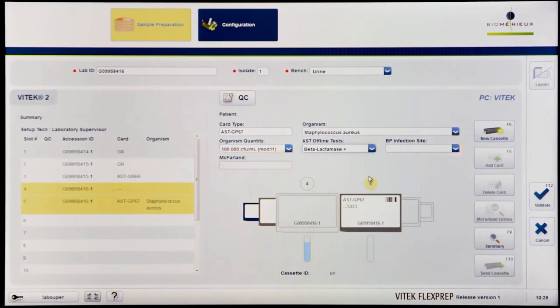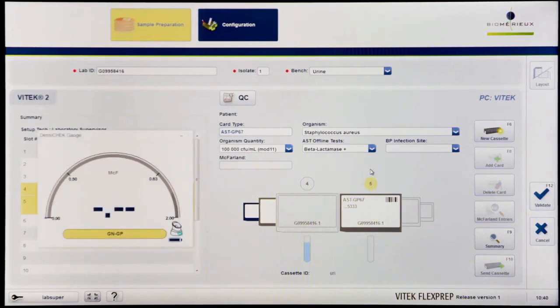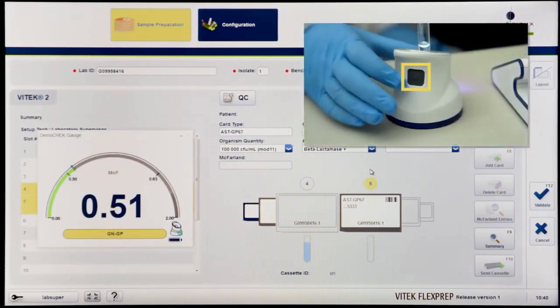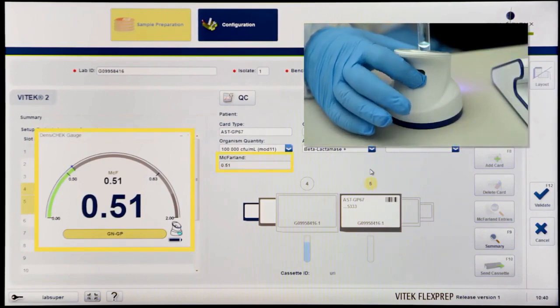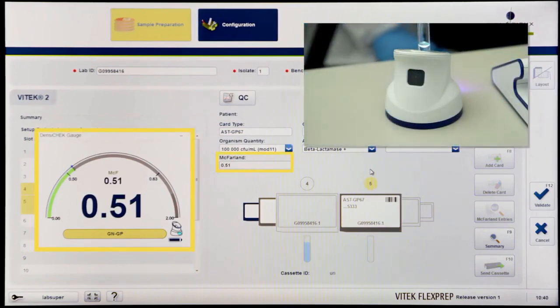Prepare the organism using well-isolated colonies of an appropriate age from an appropriate media. The Vitec Densa Check will indicate if the suspension is of the correct turbidity or requires adjustment. Press the button on the back of the pod to transfer the accepted McFarland value onto Vitec FlexPrep.